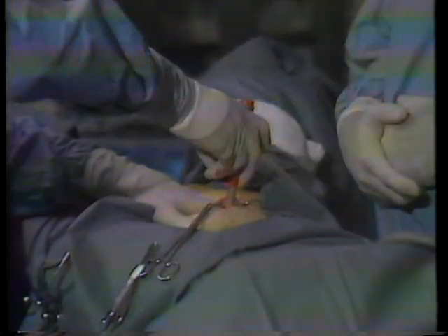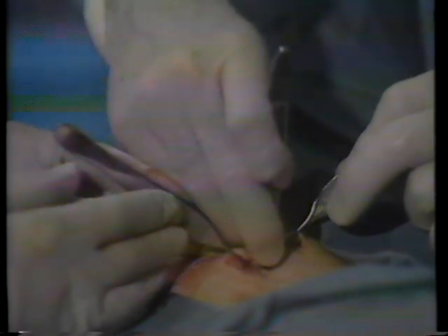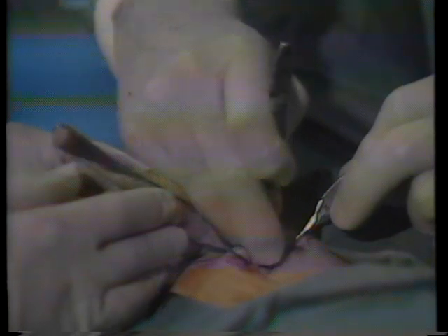You have seen many of the organs your doctor will see when he does your procedure. He may be performing laparoscopy to help make a diagnosis or to operate. Before laparoscopy, a large incision had to be used to perform this examination; now you will be able to resume your activities much quicker than was previously possible.